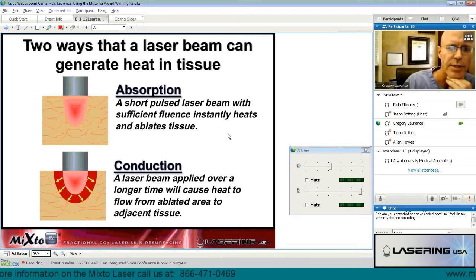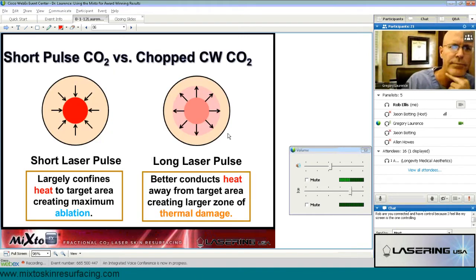Again, you can see the energy is absorbed. Once you reach a certain amount, the tissue is actually vaporized. There's always a zone of coagulation right outside of that. And that zone of coagulation is critical because of how it works, and we really don't understand. So this is kind of looking through a cut through like a donut. We're looking at a zone of vaporization.